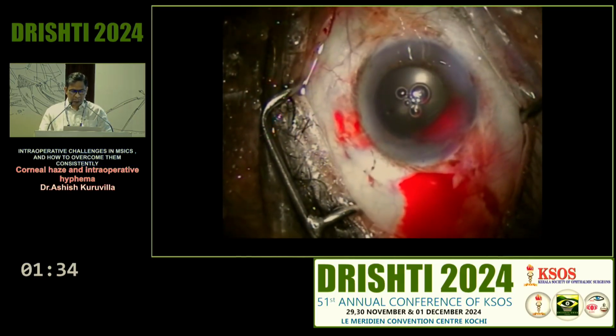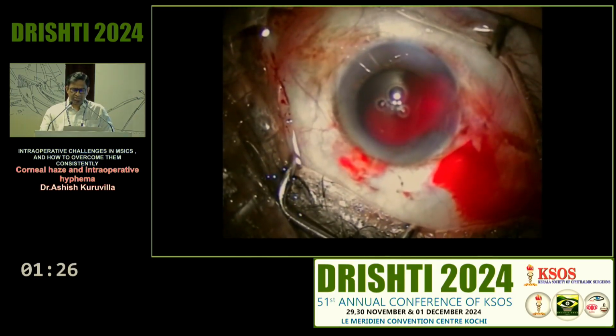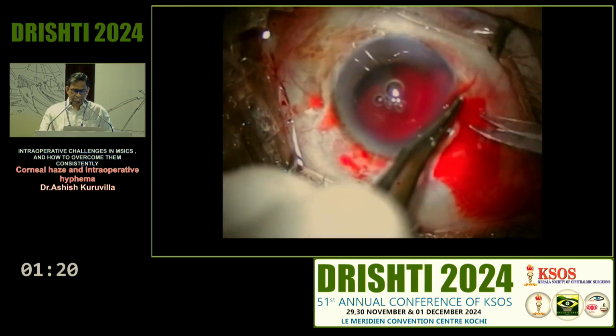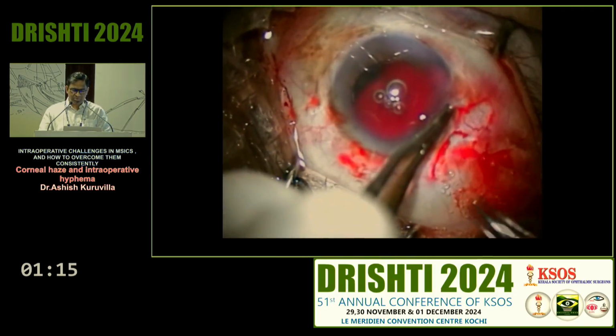So corneal lip has to be very good. And even after that, in this case, you can see the corneoscleral lip there is no problem, in the internal incision either, but there is significant amount of bleeding. So I knew this was a major bleed. So I had to see what was going on. And by retracting the conjunctiva, since I do a transconjunctival incision, I was able to see what the problem was. There it is.